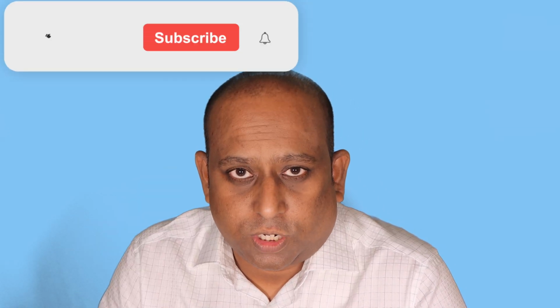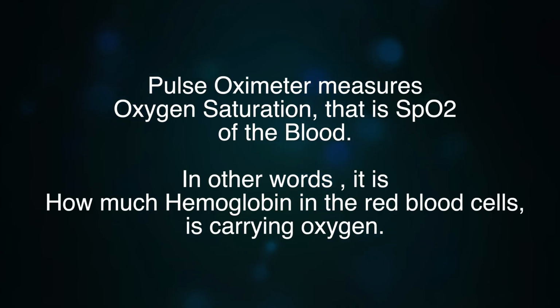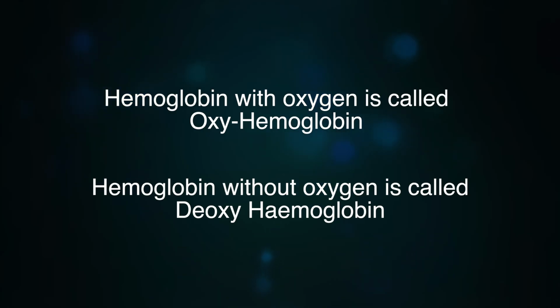So our aim is to measure oxygen saturation, that is SpO2. The pulse oximeter measures how much hemoglobin in the red blood cells is carrying oxygen. Hemoglobin with oxygen, we call it oxyhemoglobin. Hemoglobin without oxygen, we call it deoxyhemoglobin.